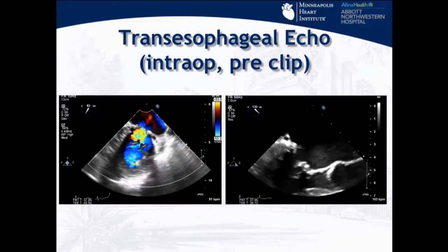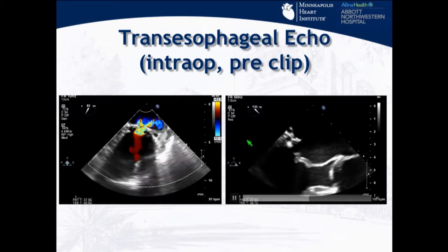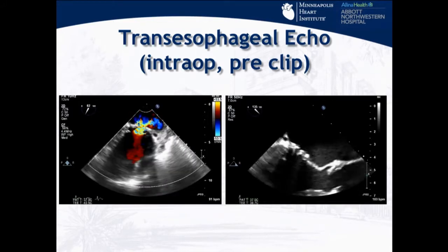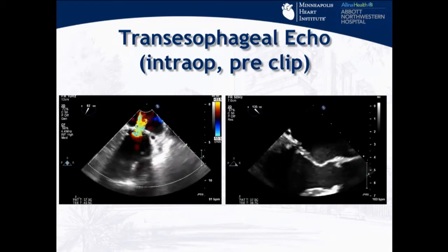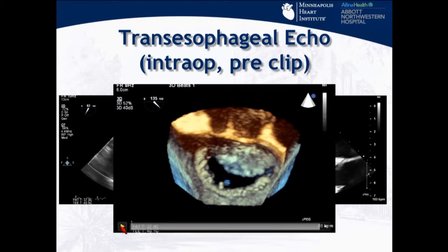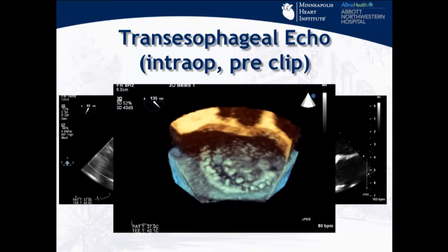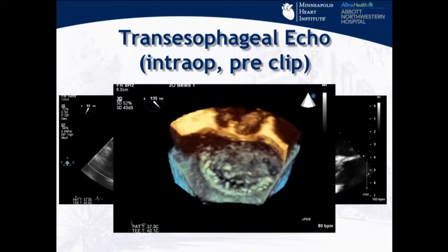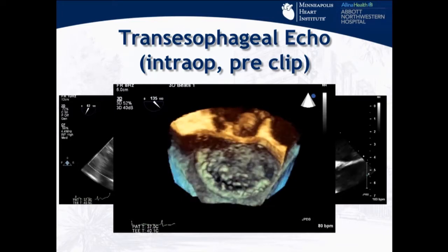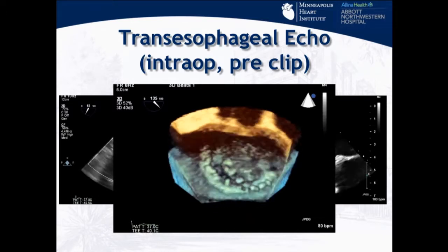These are the pictures from intraop, but you can see here the ring. Part of the ring, you can see that the posterior leaflet is really, really small. The anterior leaflet, though, is pretty long, but you have severe MR. And then I have to play this for some reason. I always click it. So here's the 3D TEE, and I can just fully agree, obviously you need someone like Richard and all the other excellent echocardiographers in our institution to actually get these pictures so that you can plan your procedure well. Otherwise, it just doesn't work.